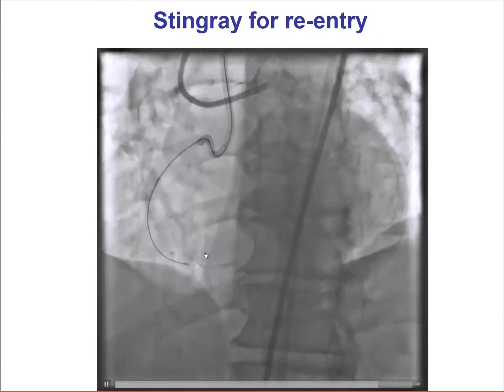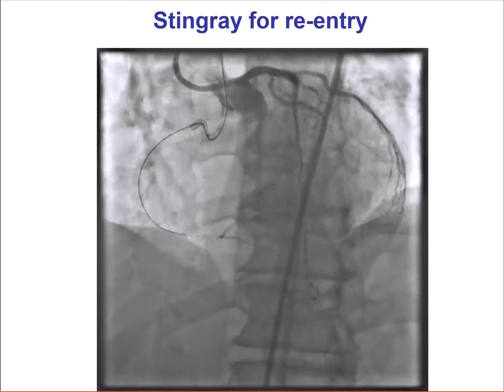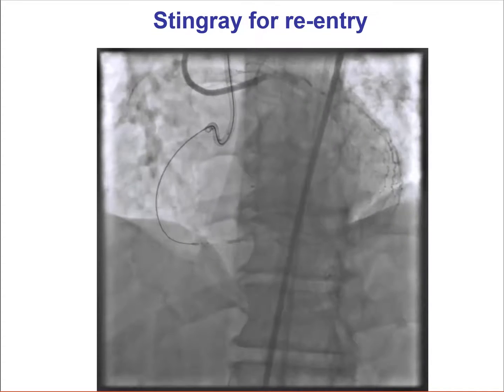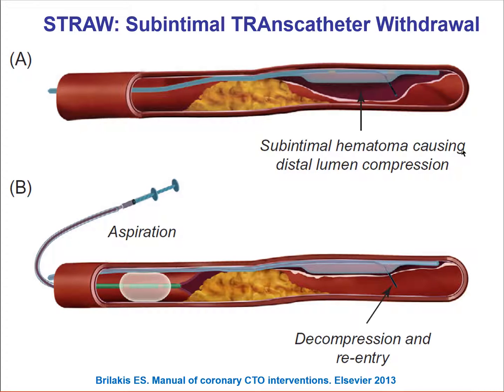Here is the Stingray balloon inflated in the distal right coronary artery. We can see that there is some compression of the distal true lumen, most likely by hematoma formation in the subintimal space. This is not uncommon in subintimal dissection reentry. One way to address this is by using the so-called STRAW technique — subintimal transcatheter withdrawal — in which the goal is to decompress the hematoma by advancing a second over-the-wire balloon and aspirating through it, re-expanding the lumen distally and facilitating reentry.